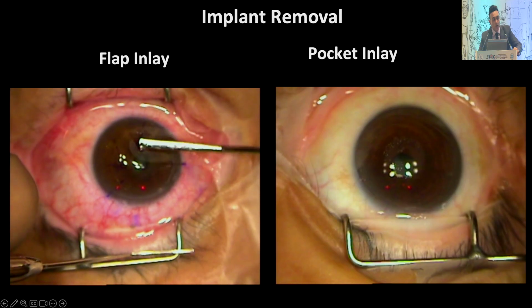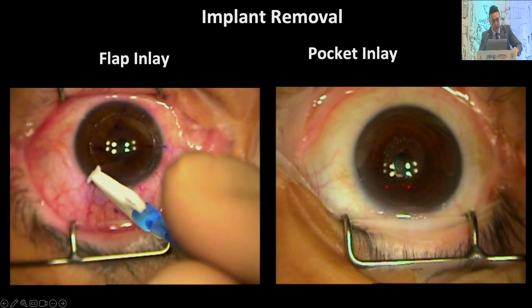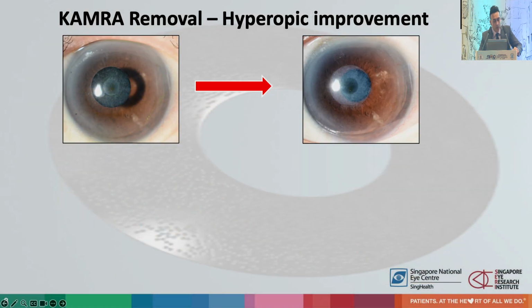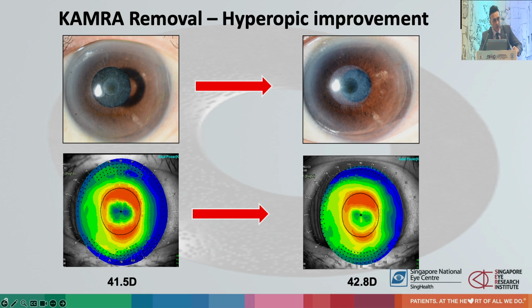The imprint of the device is there, and I'll talk about it in a little more detail, and that's really what we're going to have to talk about to get this removal. So this is an example of somebody pre-explantation. You can see obviously the haze formation still there post, and you'll see some improvement with respect to the change on the tomography on the surface following explantation.